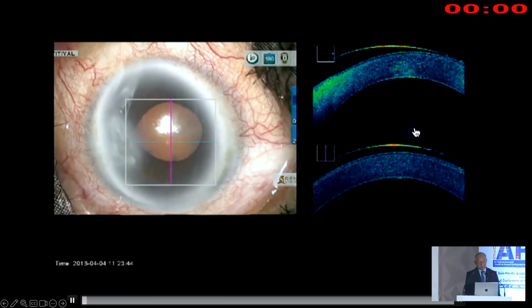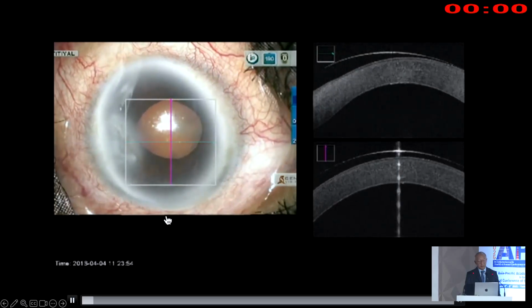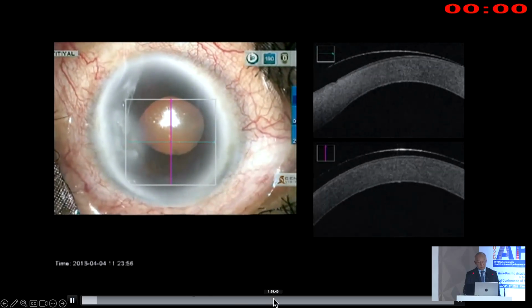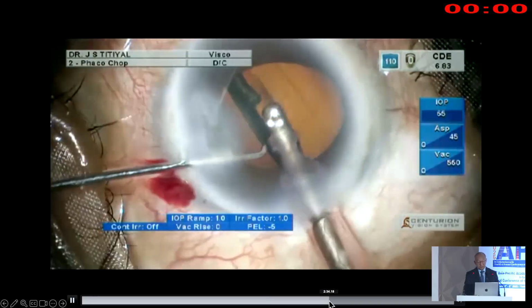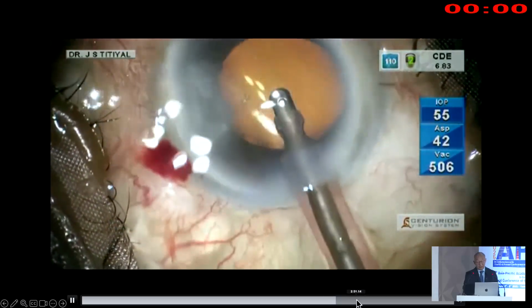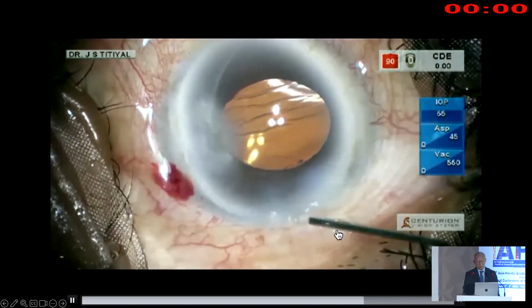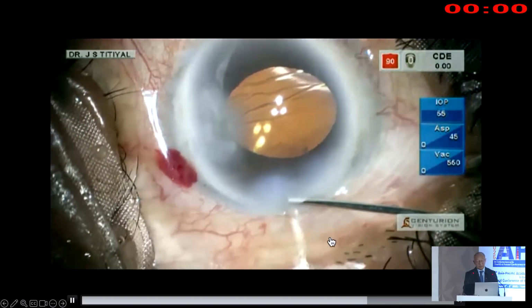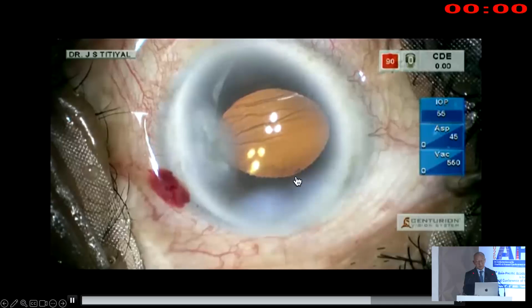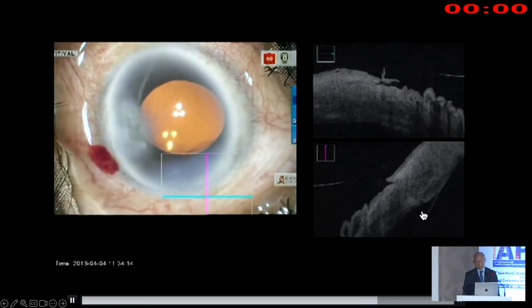This is one of the classical videos I have from one of my patients with an endothelial compromise case, Fuchs case. I did a phaco effectively in this patient, with a hazy cornea, and implanted a monofocal IOL. When I was doing hydration in this particular case, I realized this is one side, this other side, a little bit of frill I could see when I did hydration here. I opened up my OCT microscope. I could realize there was a wound side Descemet detachment.